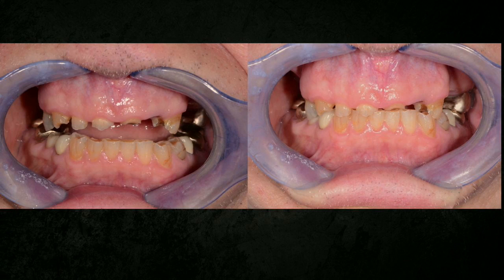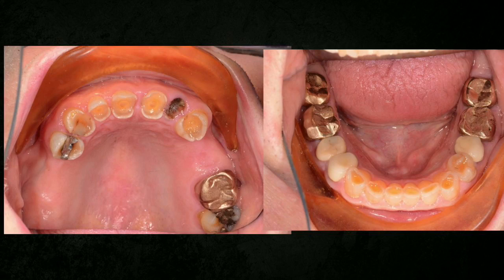So the question is, are these teeth savable? You want to look at periapical radiographs and the perio. I felt like we were going to need a lot of crown lengthening for aesthetic purposes anyway. A więc tak, patrząc na tego pacjenta, można by się zastanowić, czy te zęby da się w ogóle uratować, czy da się je odbudować. No na pewno wiedzieliśmy, że będzie potrzebne wydłużenie koron klinicznych tak czy inaczej, ale zaczęliśmy sprawdzać, jaki jest stan przyzębia, jak to wygląda u pacjenta.